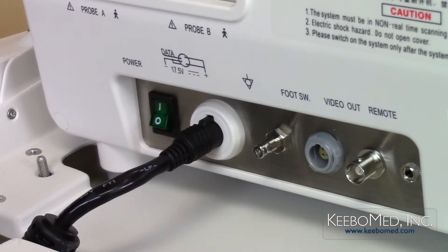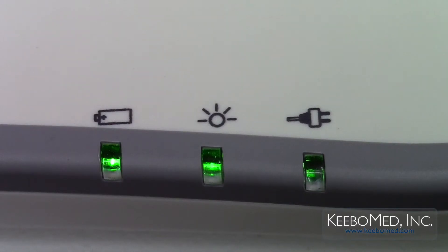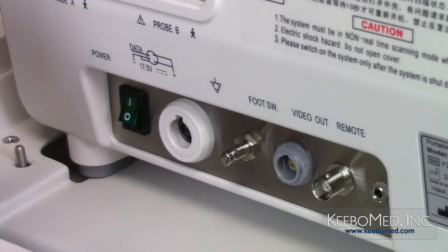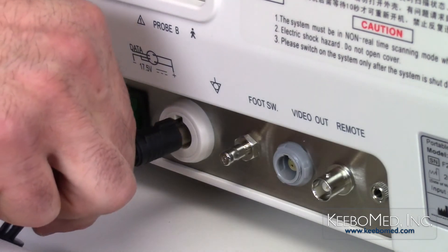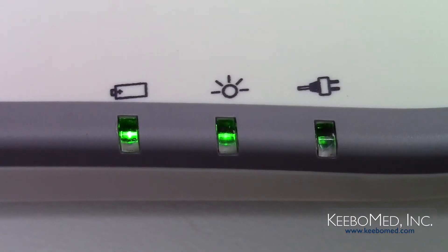If the ultrasound system is already turned on, simply disconnect the output plug of the AC adapter, and the system will automatically use the battery as a power source. When the battery power becomes low, connect the AC power adapter to the system to charge the battery and continue using the system. This can be done without the need to power the system off.